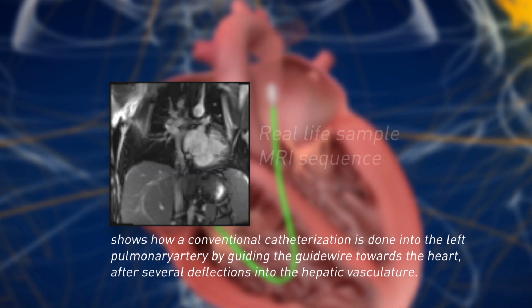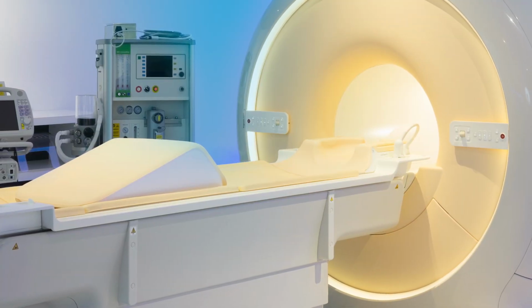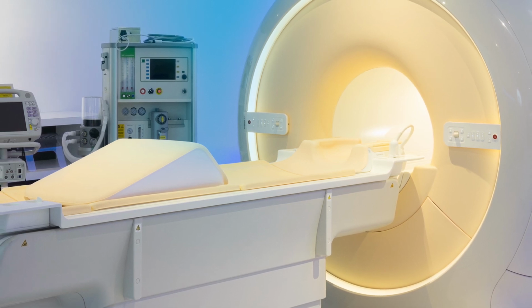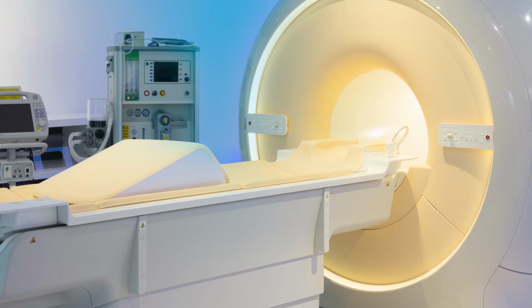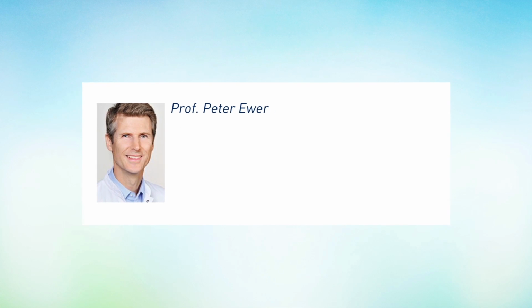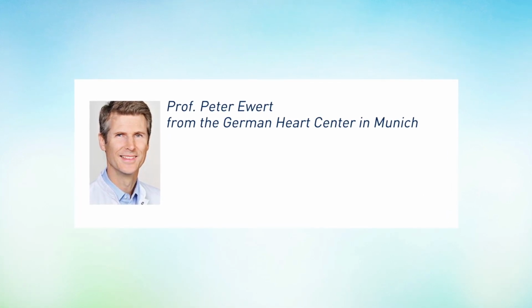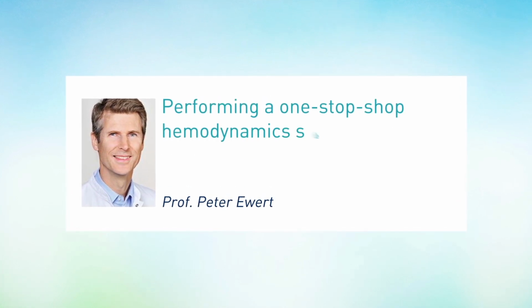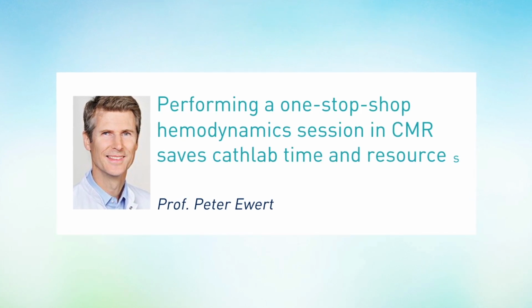The procedural setup requires MRI conditional monitors being present for the examination. Such monitors are meanwhile available from various suppliers. The process therefore needs investment into equipment which is dedicated to be used under MRI conditions. Professor Ewert from the German Heart Center in Munich has invested considerable time and effort in enabling this procedure. He quotes, "Performing a one-stop shop hemodynamic session in CMR saves cath lab time and resources."